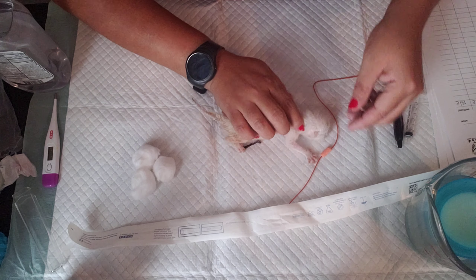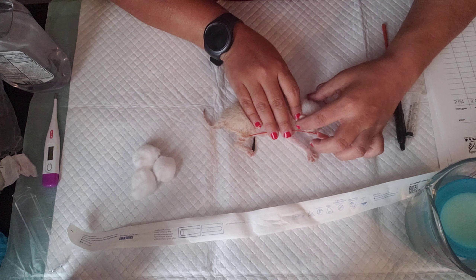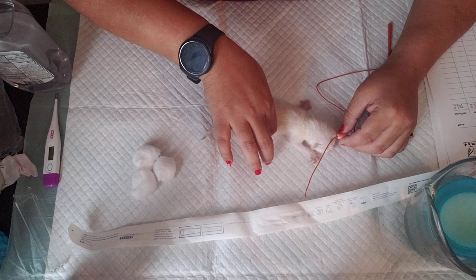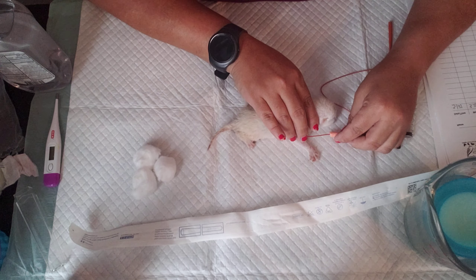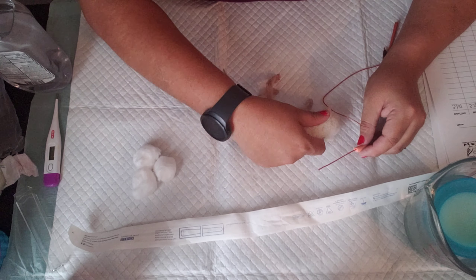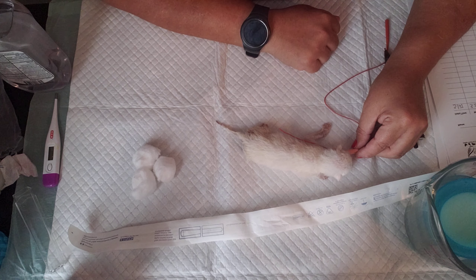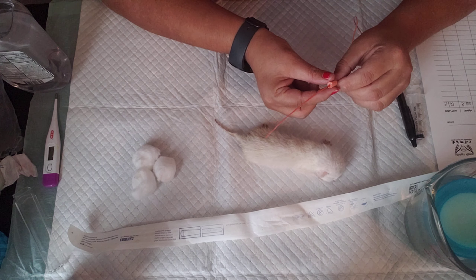You measure by going from the mouth to right below the middle of the rib — just stretch them out a little. So you want to get an idea and you can mark it — you can mark it with a marker. I use a band-aid so when I disinfect, I just check it off and throw it away. That way I can disinfect real easy.